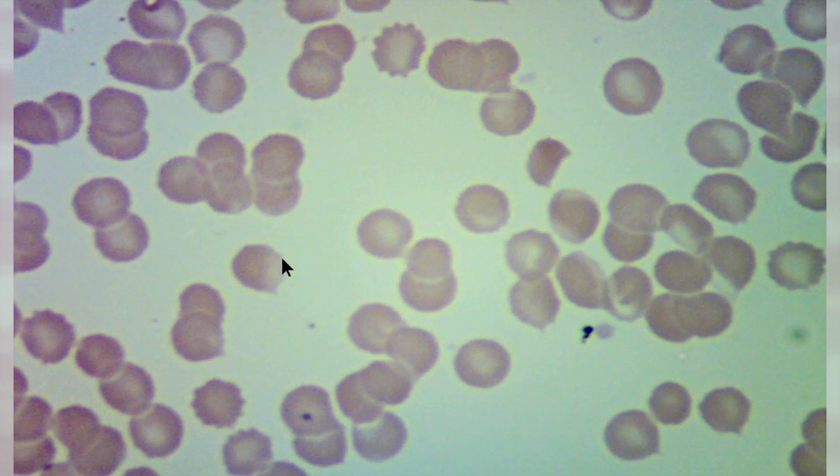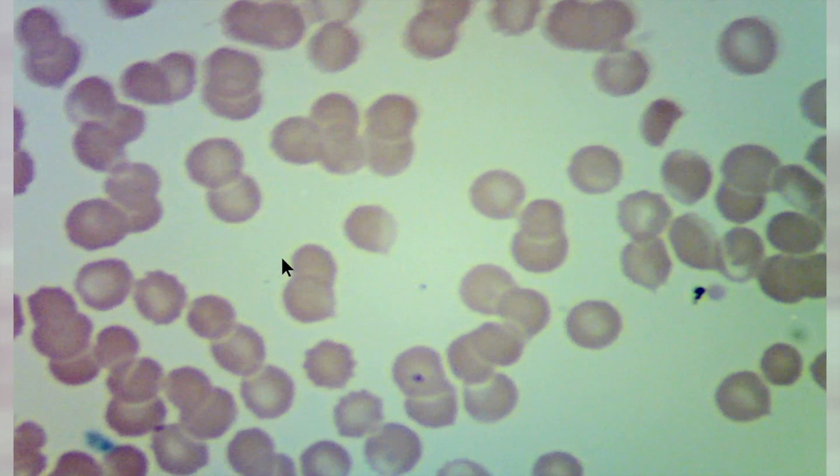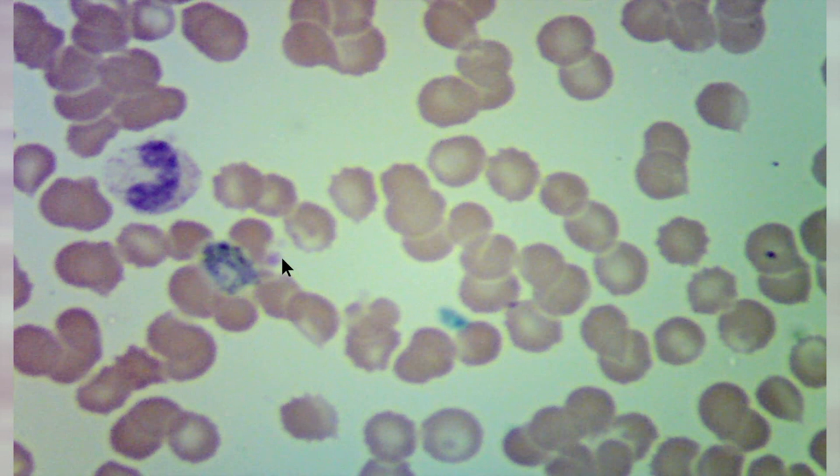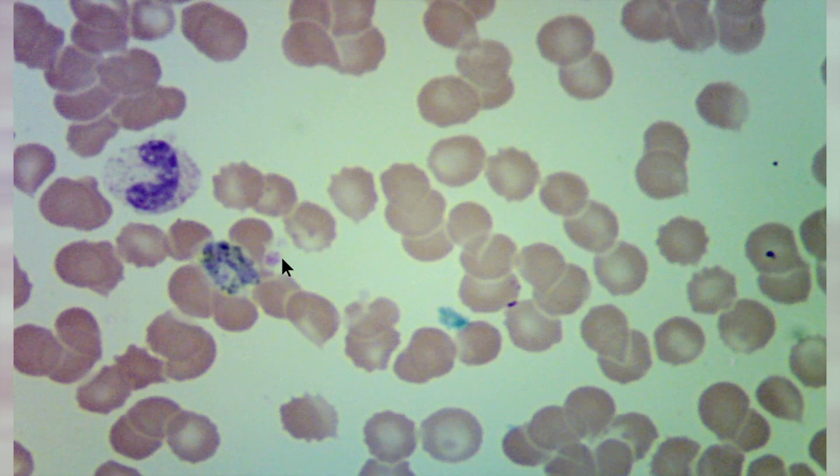Looking for these abnormalities, you should be very patient with the process. Don't expect the first 2 or 3 fields to be able to find a malaria parasite. You have to be patient. You have to go meticulously through each field. Of course, patient history would be of tremendous help in this case, because then you can make thicker slides. That's going to increase the chances of detection for malaria.